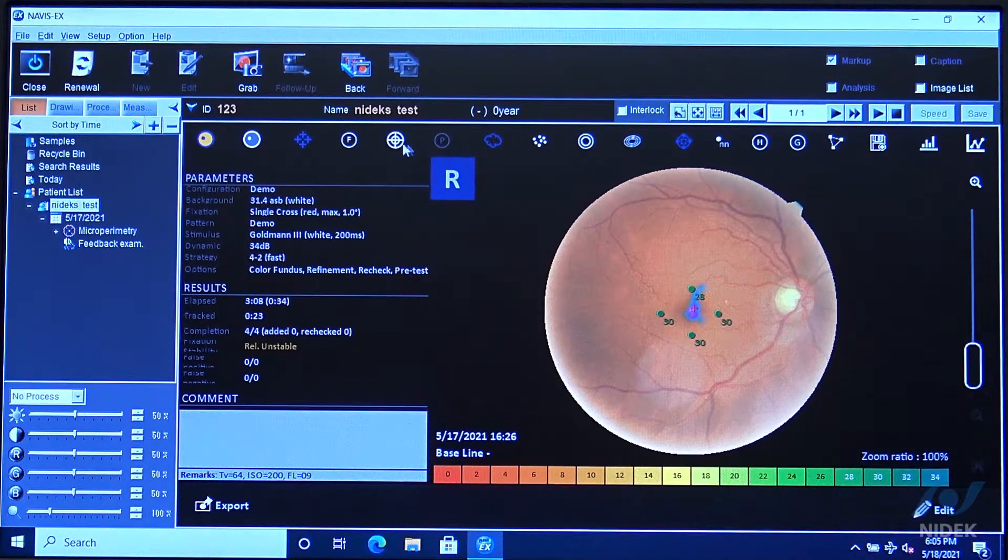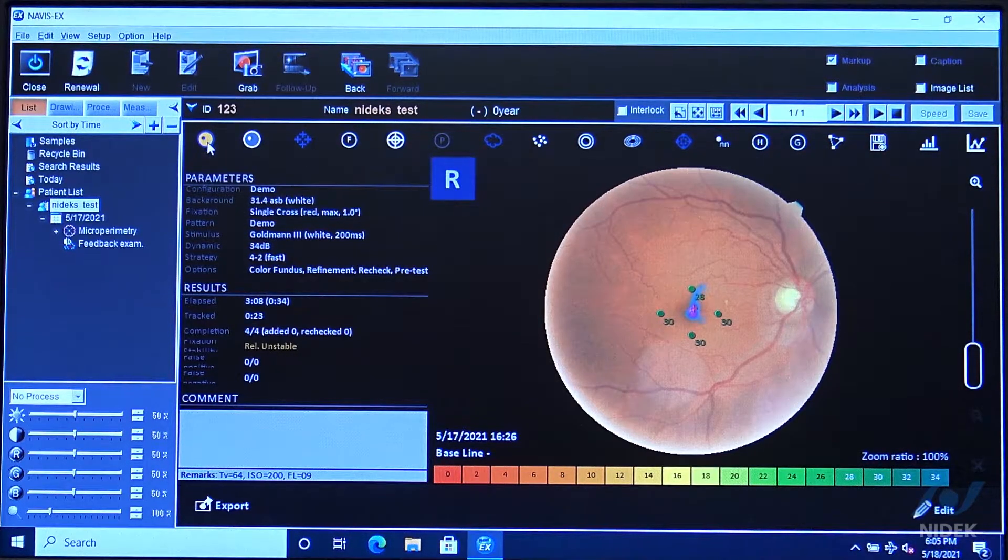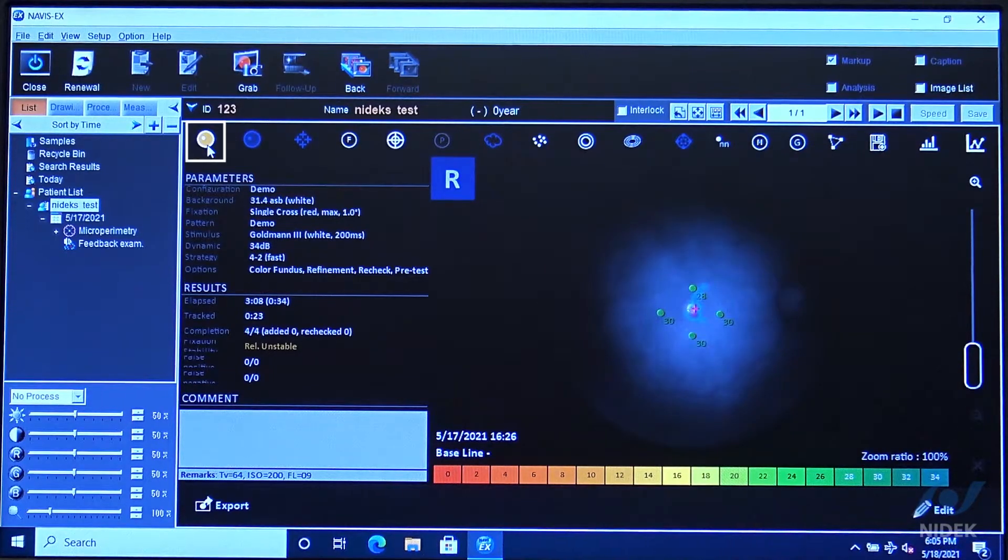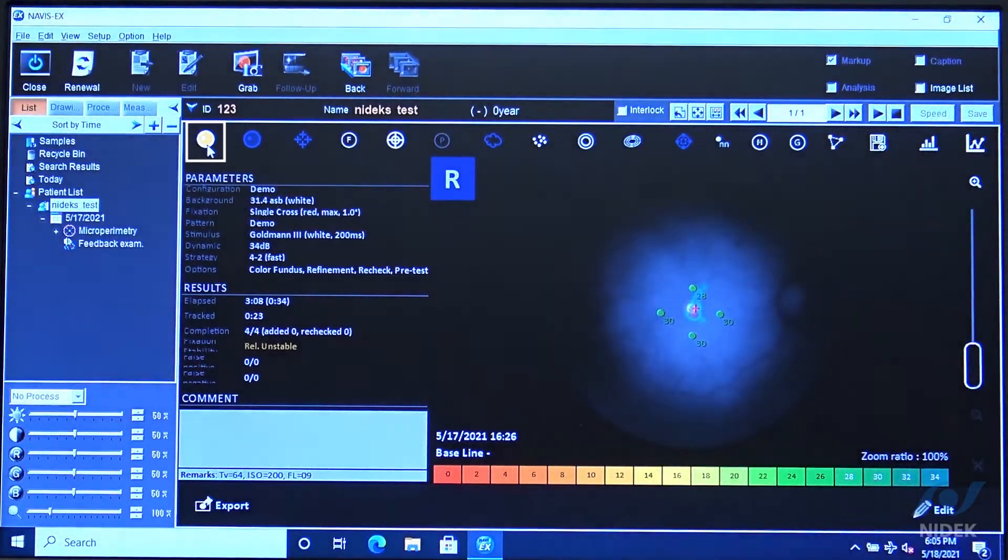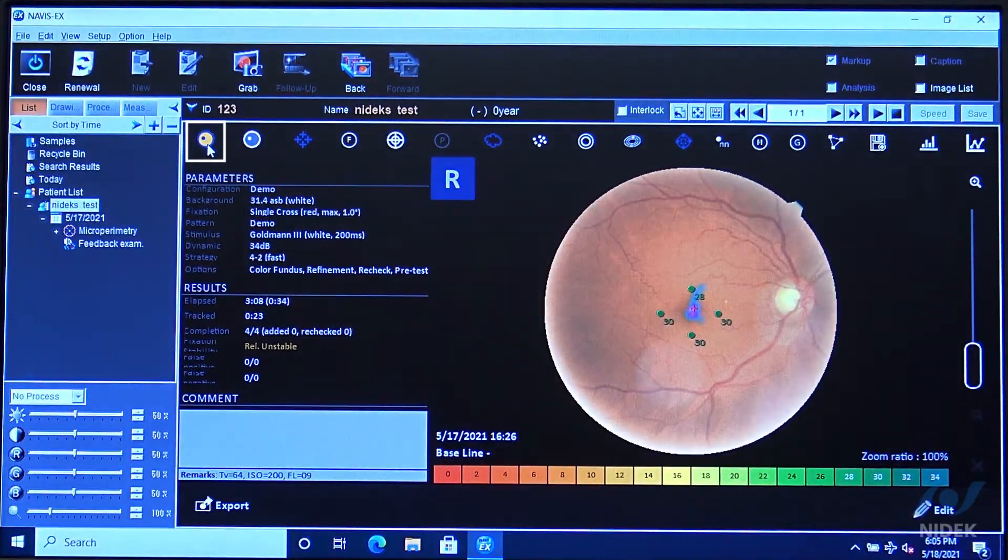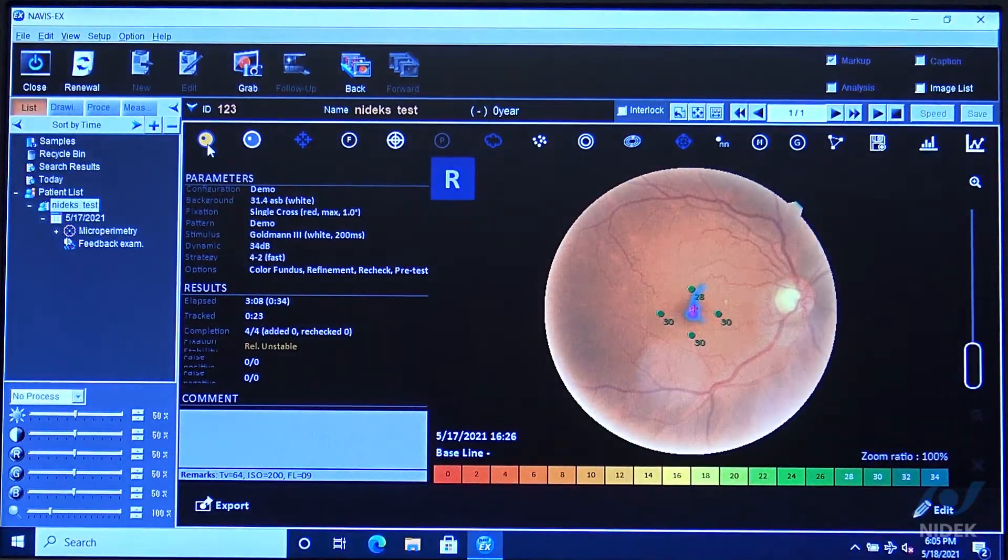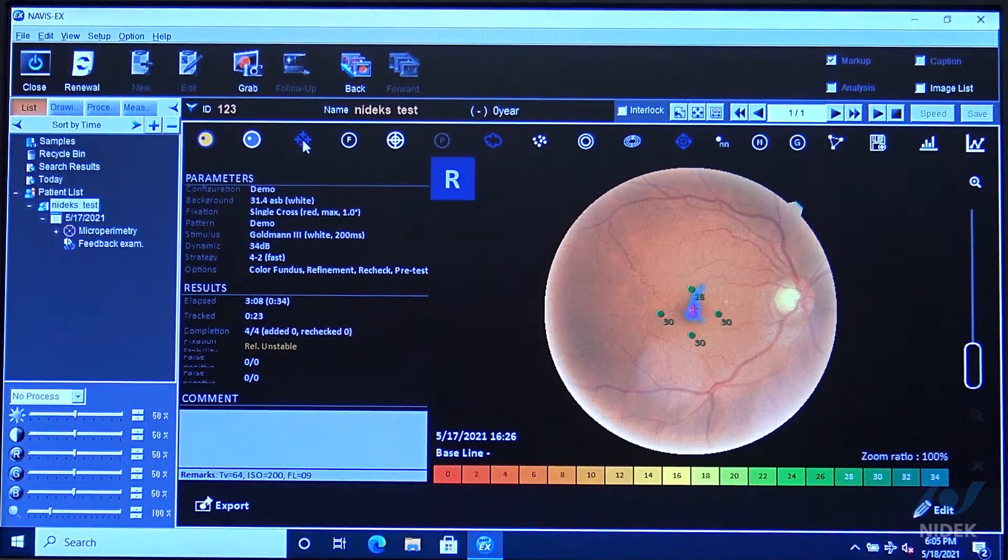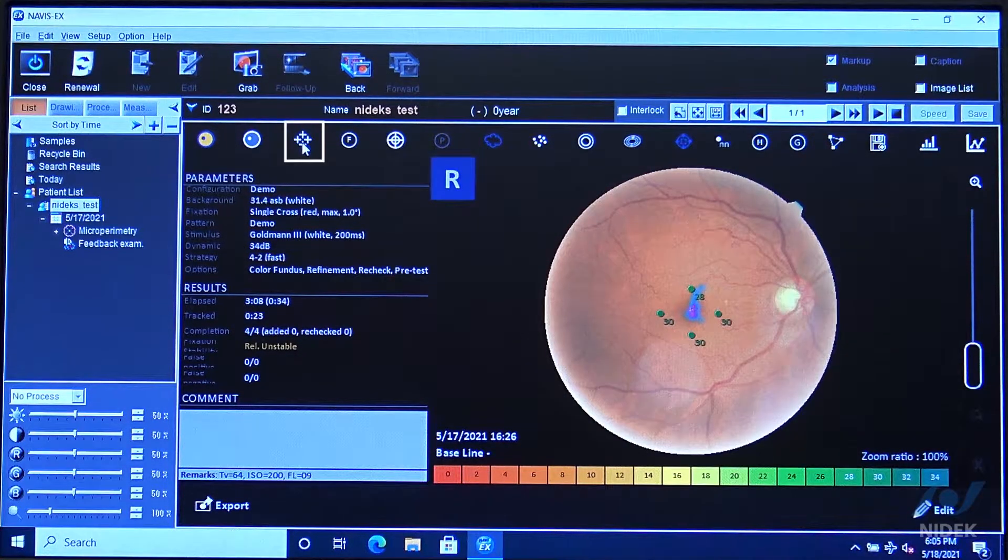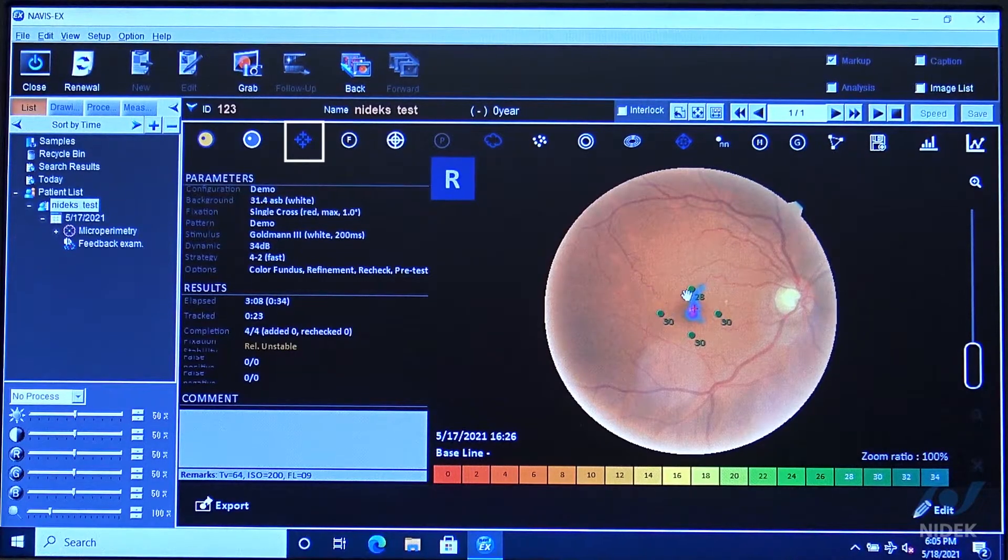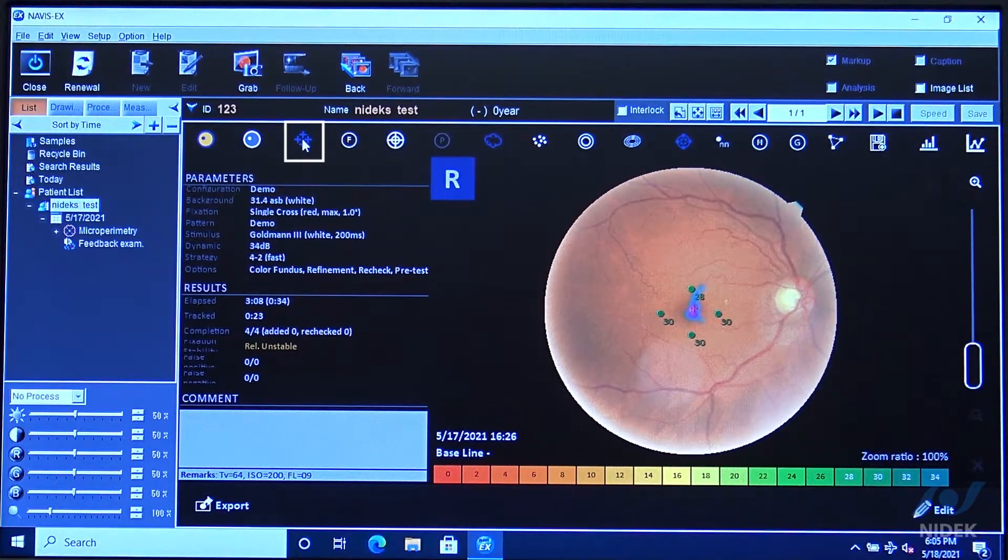We also have some icons at the top. I'm going to briefly go over what they are. If I select on this icon, it's going to change from the infrared to the color image. This icon here is going to take the fixation target off of the color fundus image.